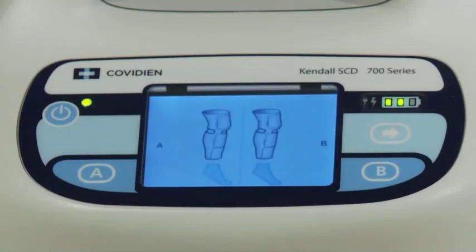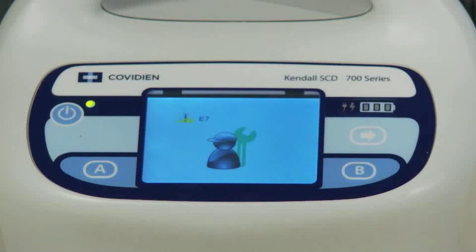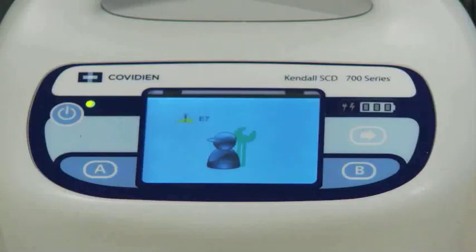The last alarm resolution category is service required. When a nurse or end user sees this visual, the controller should be sent to the hospital's biomedical engineering department. The animated alarm resolution feature on the 700 series controller will clearly communicate to end users and minimize time spent identifying alarm issues, helping to reduce downtime and maximize therapy as prescribed by the physician.